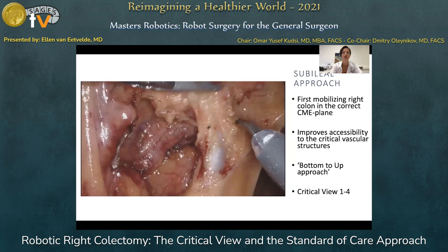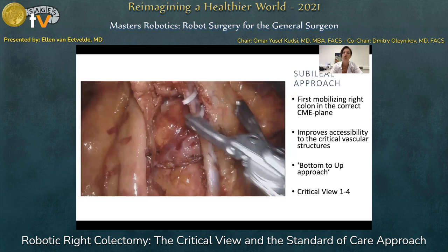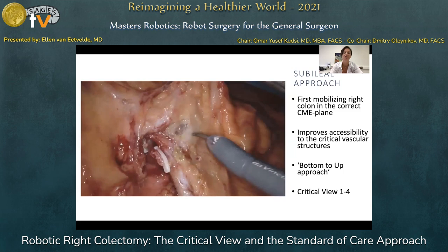Keep in mind that in right colon surgery the vascular anatomy is highly variable, and it is a good practice to always perform a study of the preoperative CT scan before embarking on CME surgery.